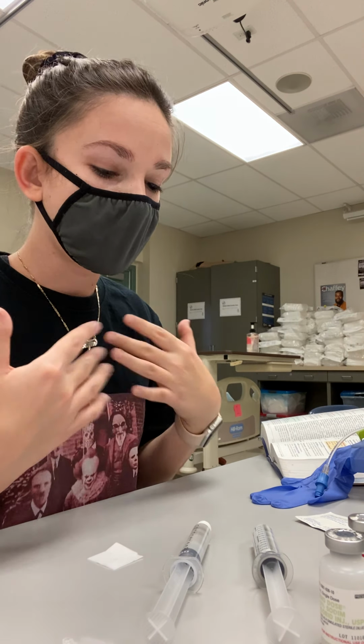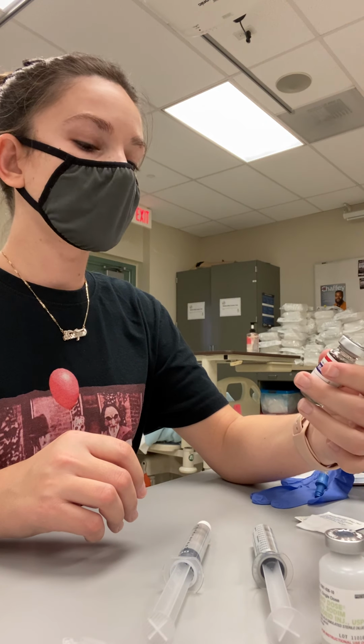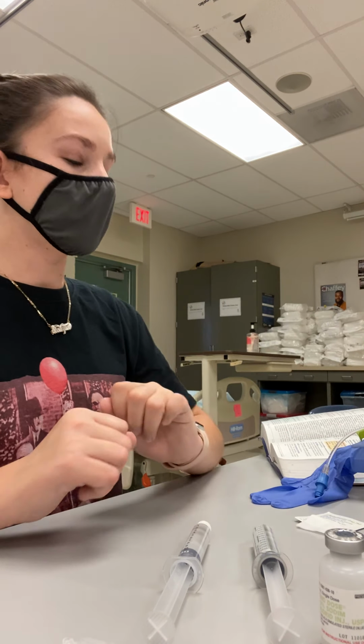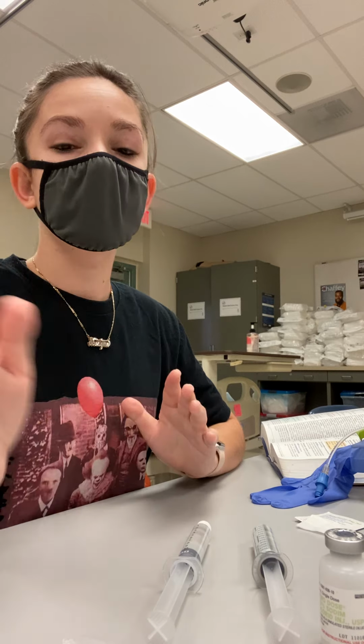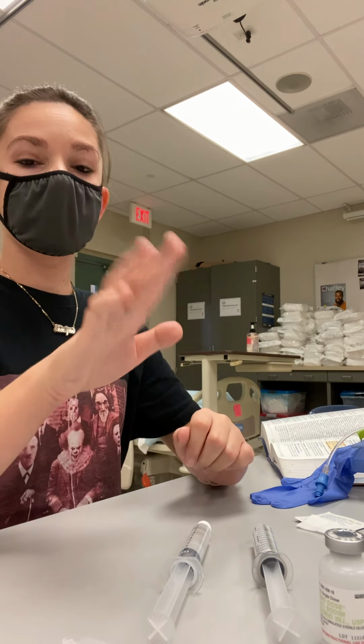Okay, so I will be doing the IV push demonstration. I will be doing the metoclopramide medication, which says you can give undiluted if less than 10 milligrams. So let's say the doctor's order is 5 milligrams. You will verify the doctor's order.